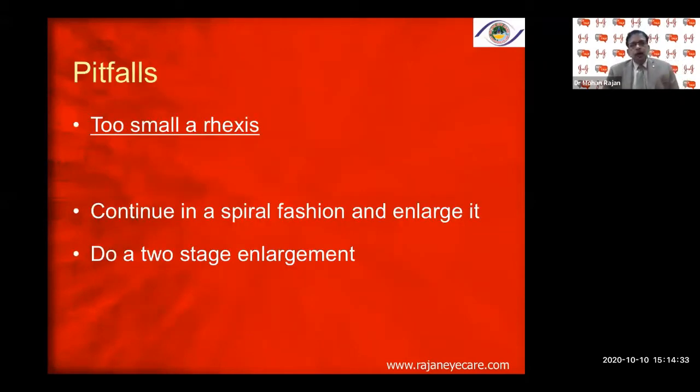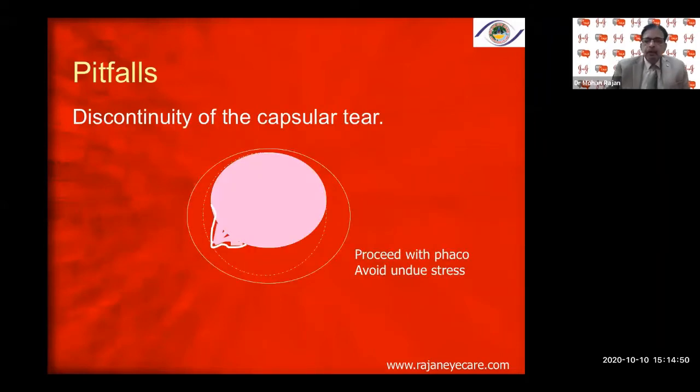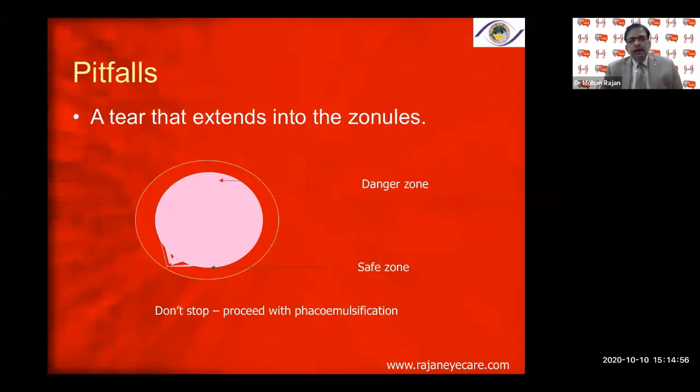If the rhexis is too small, you can do what is called a 'double rhexis' — continue in a spiral fashion and enlarge it. Do a two-stage enlargement before phacoemulsification to make sure you don't have capsular phimosis post-operatively. If there is a discontinuous capsular tear, proceed with phaco but avoid undue stress in the direction of the tear towards the zonules.